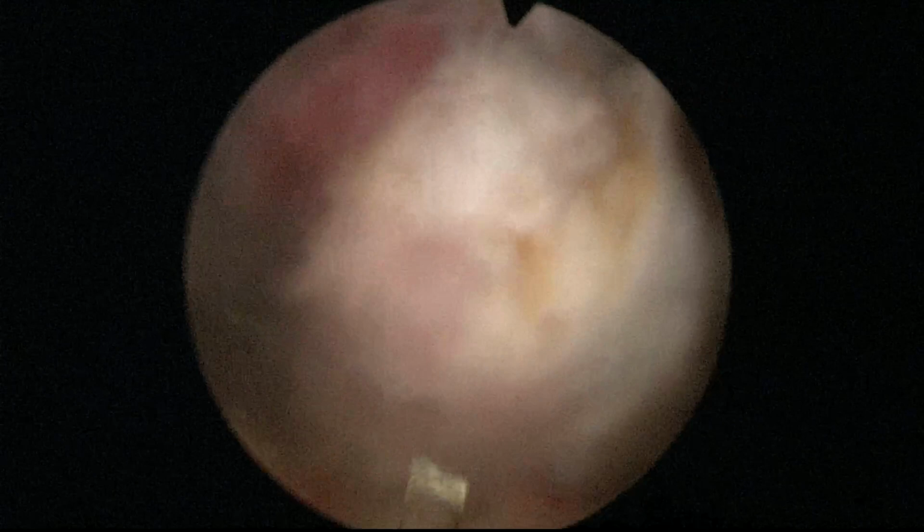And we will move on to morsellation soon, I guess. There we are. That bladder neck looks wide open. That's the edema from the catheter. And I think we will do a fast change. It was a 19-minute enucleation for a small gland in a relatively difficult case. So you see how polished this en bloc technique is, and how fast, because you can work continuously with very little pausing time, and it allows you to do these miracles where the patient is very fast, free from his catheter, and happier after this. Of course, the tissue was sent for histology.